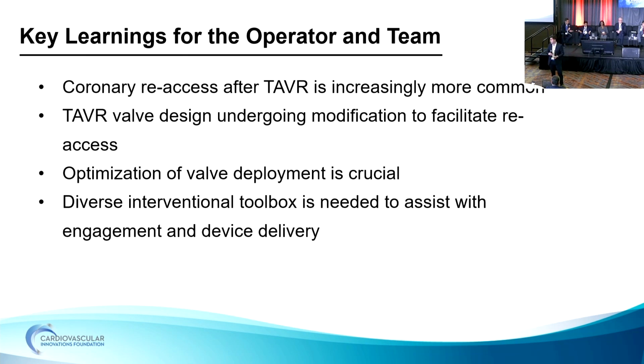So they'll have your older generation valves, and they might not have been deployed with commissural alignment. So you've got to be ready to use your toolkit. Perfect. And the patient stays stable through all this and sailed away. So yes, the patient got discharged home the next day.